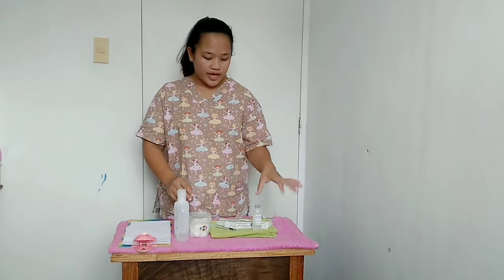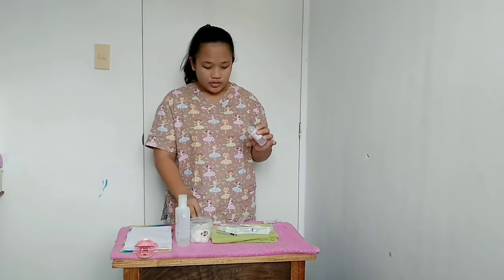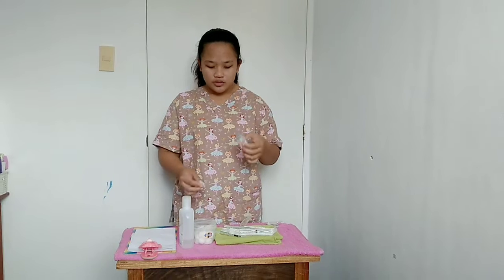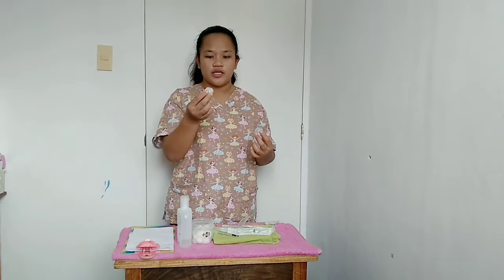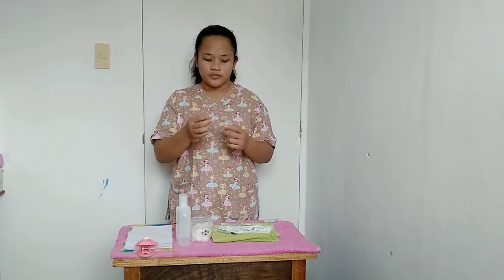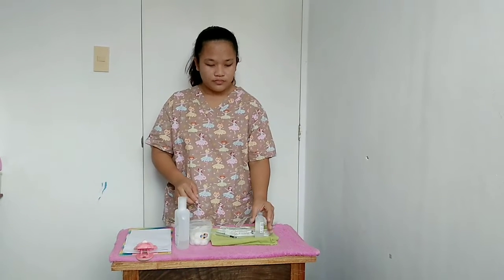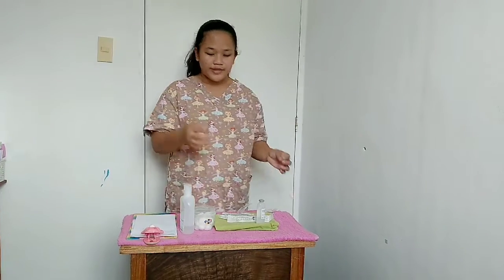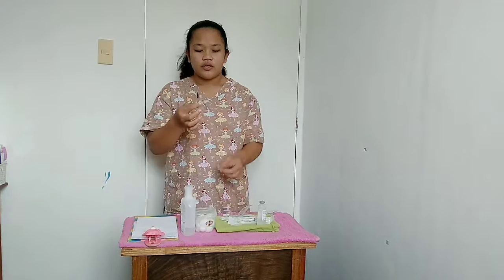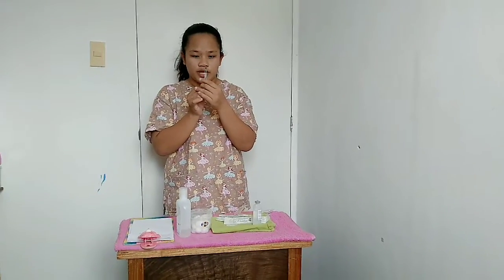Then we are going to get the sterile water or the medication and clean the top or the rubber seal of the medication using a cotton ball soaked in 70% alcohol. Now get the syringe, uncap it, and draw air inside the syringe.